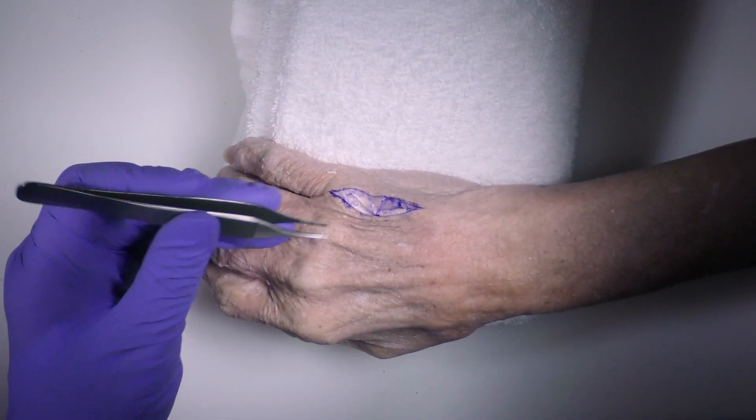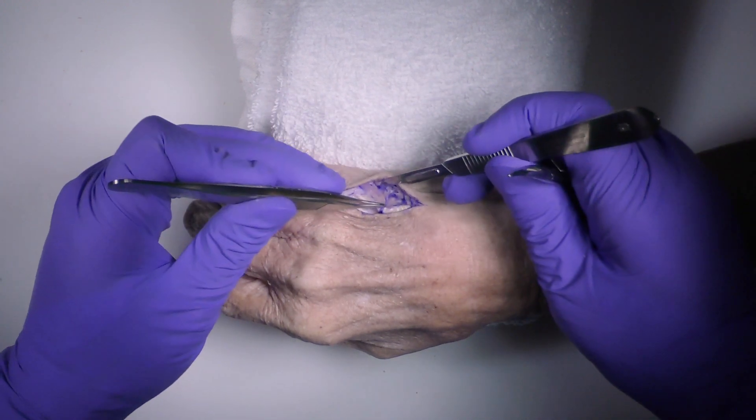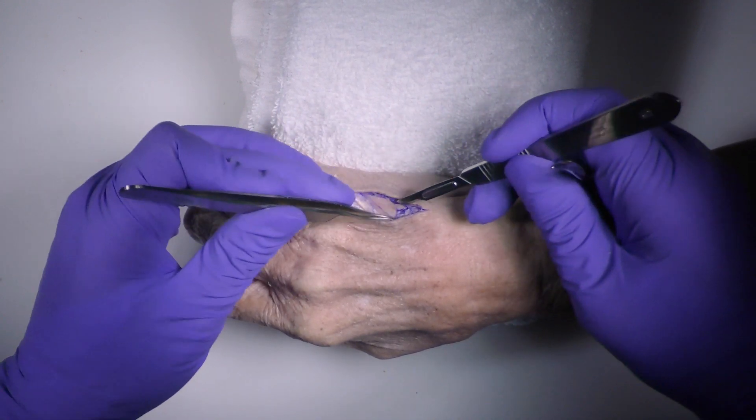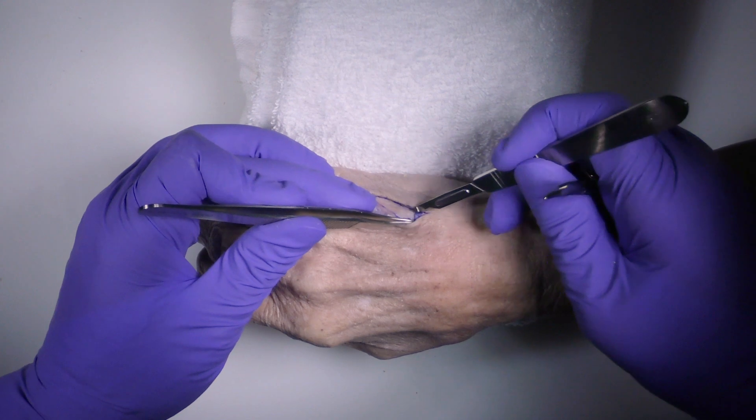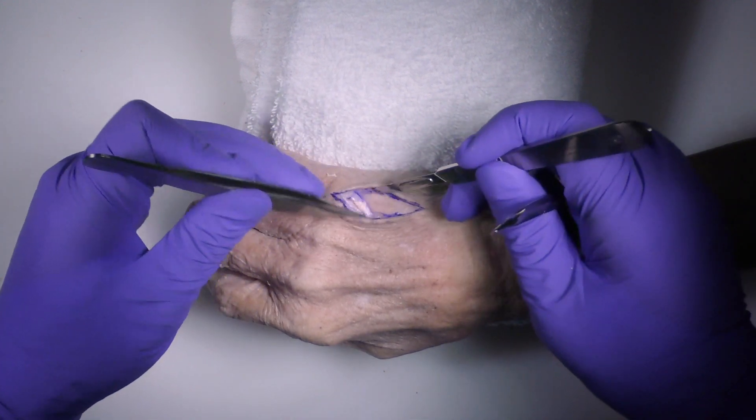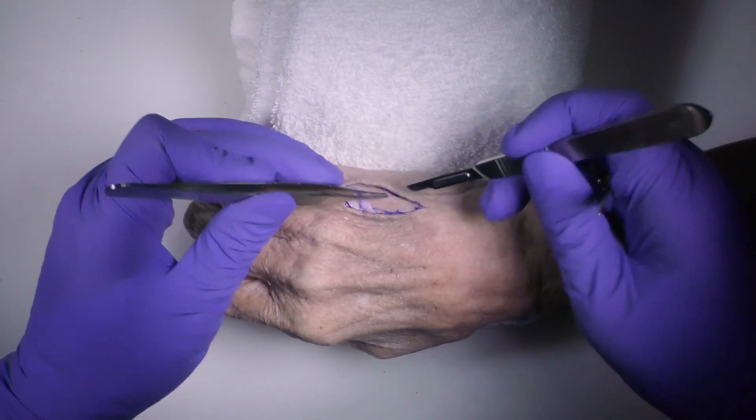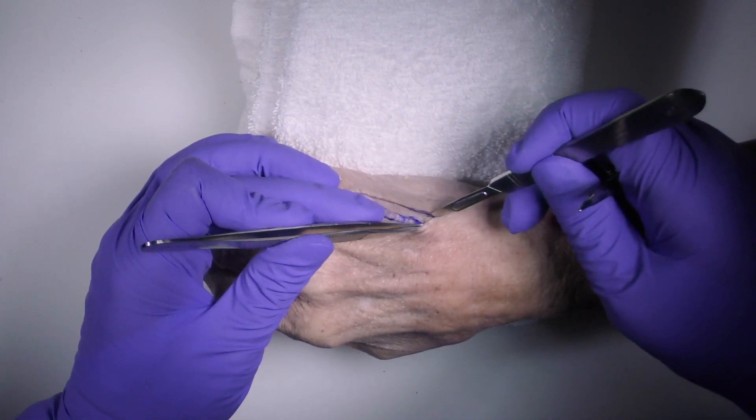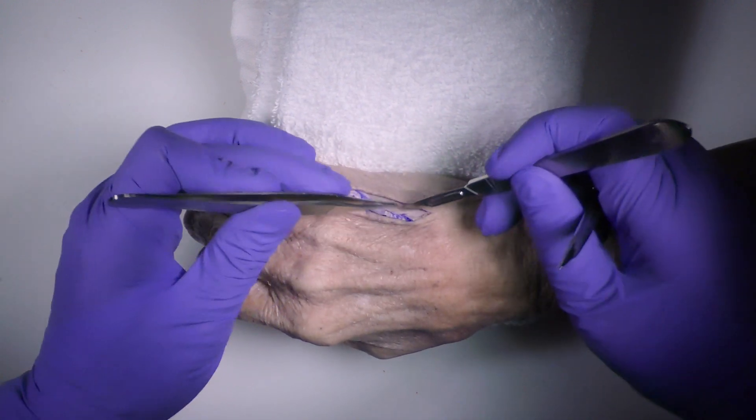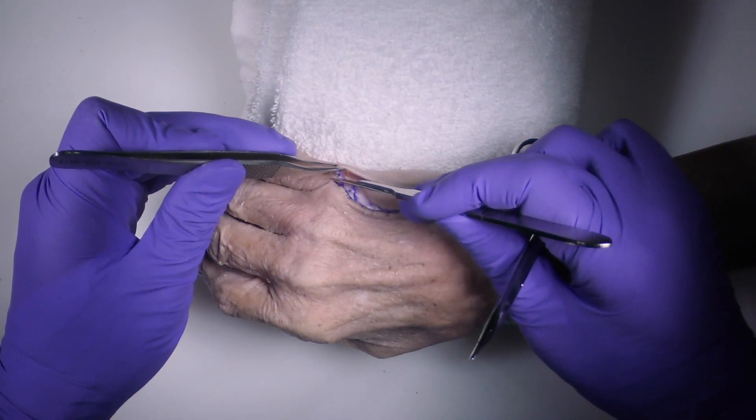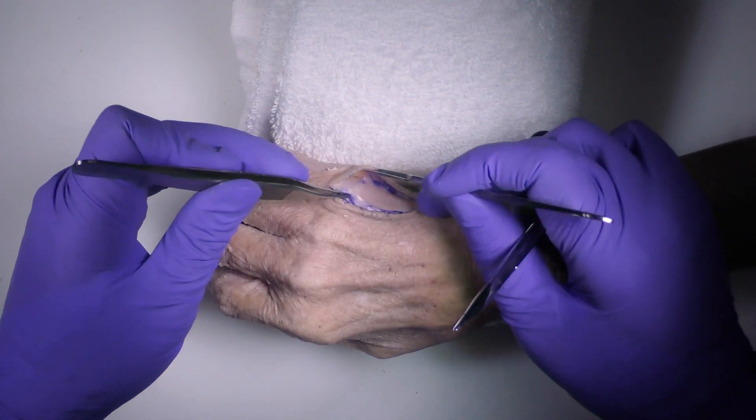So typically we go ulnar to that. And we for the most part just leave it alone. We don't want to do much with it. When you're dealing with the other fingers, you often have to go through what we call the juncture tendinae to mobilize that space. So we'll do that if we need to. But here, the advantage of this technique is we really don't have to do that, which is nice.